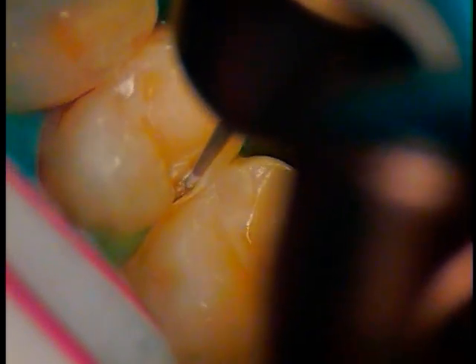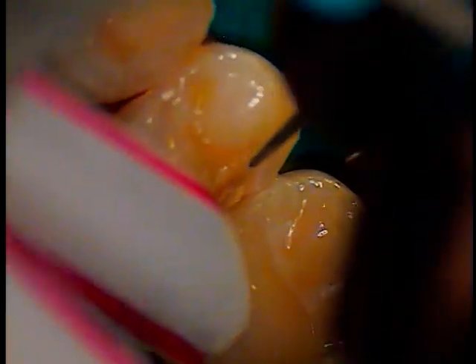Okay, so the problem is you can't see the radiograph from here. So again, you can see how that enamel just flakes away and didn't touch the adjacent tooth at all. She's going to go ahead and rinse that off and dry it. Okay.